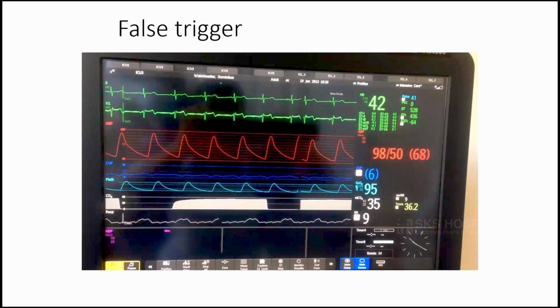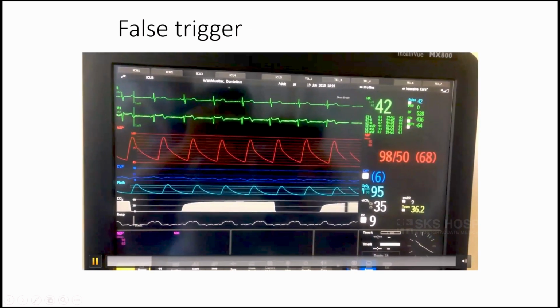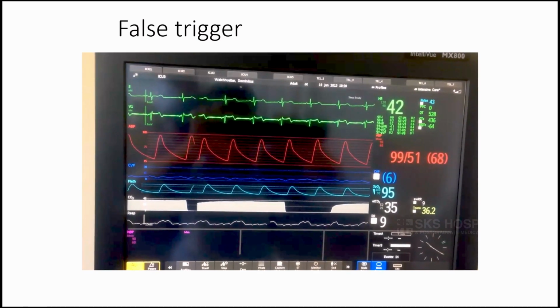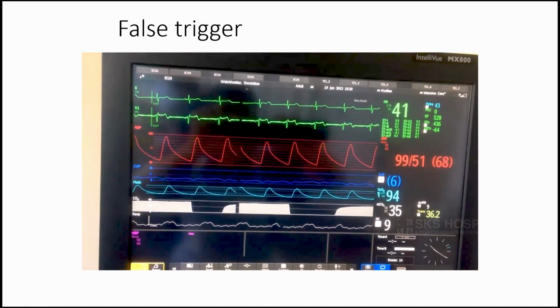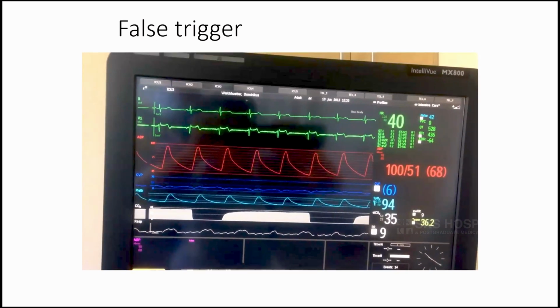So this is a patient on a ventilator, connected to a monitor which shows the end-tidal carbon dioxide here. And this is the breath rate, and the set rate is about 9, and that is the expiratory phase. Let's run this video, and you see it doesn't change. Okay, that is the exhalation. This is how the graph goes, and there are no extra waves here. So the ventilator ventilates correctly.